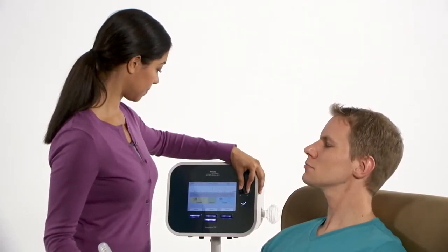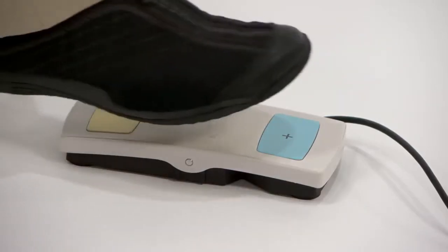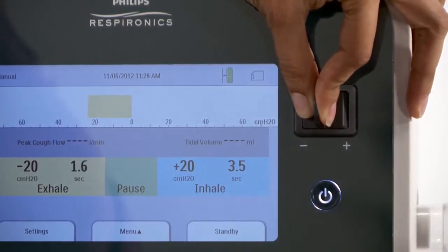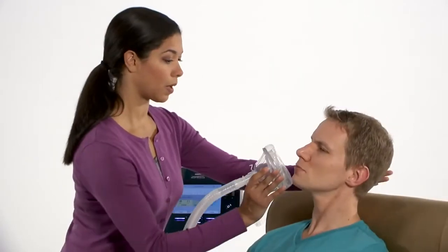If you are operating CoughAssist E70 in manual mode, slide the control lever to the right to trigger an inhalation, or press forward on the optional foot pedal. When the inhalation is complete, slide the manual switch to the left or press back on your heel for an exhalation. Position the mask, mouthpiece, or trach adapter on the patient.